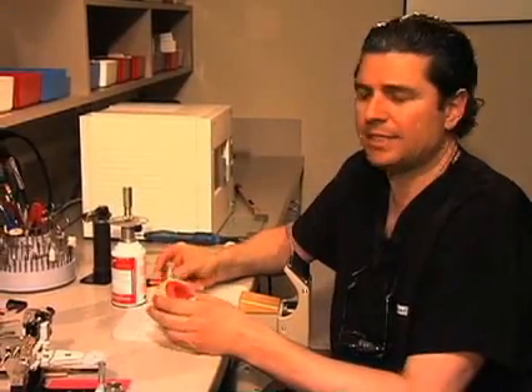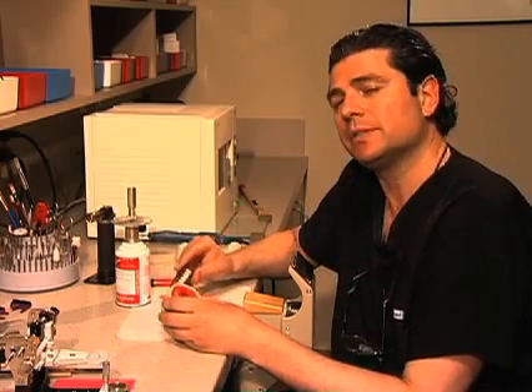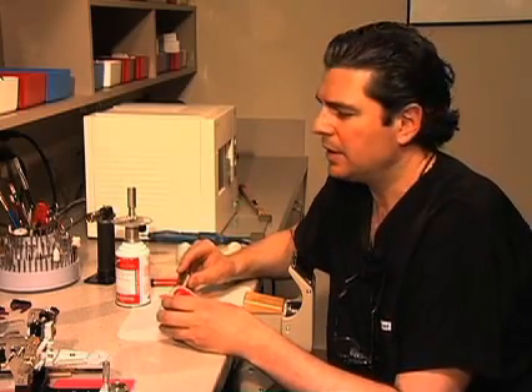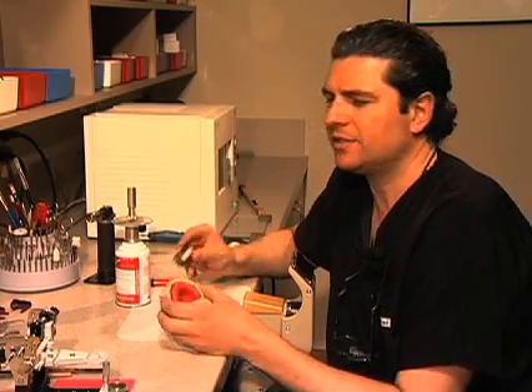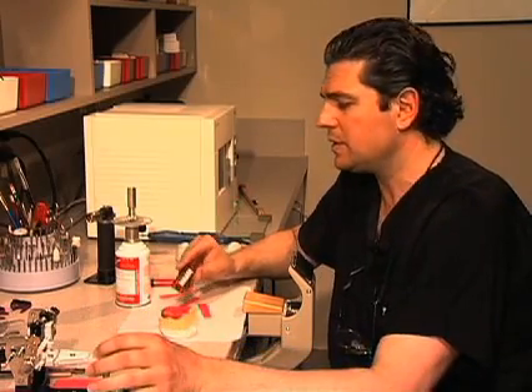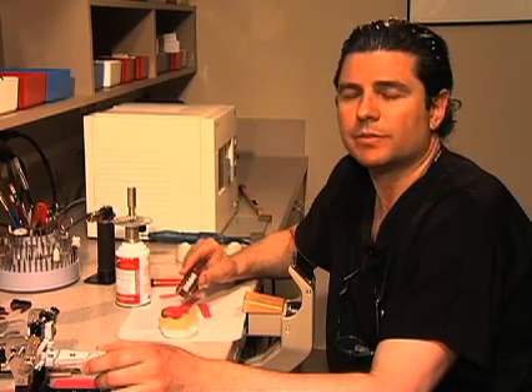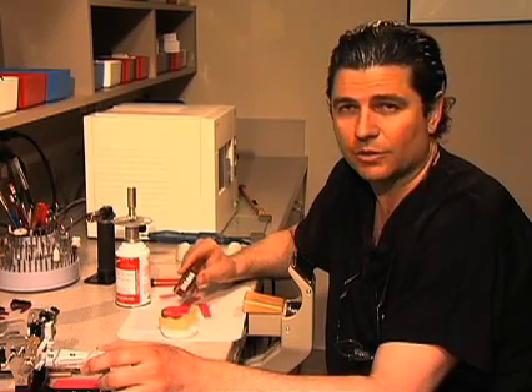With the Falou system, as with any denture setup, the most important and critical first step is to set up teeth 6 through to 11. This is a procedure that is not done with any of the Falou mechanisms — it is done freehand. However, there is the incisal table to help with the setup, and I'm going to utilize that and show you all how that works.